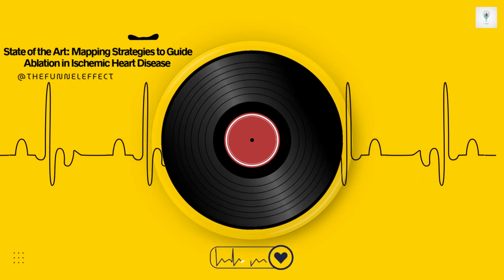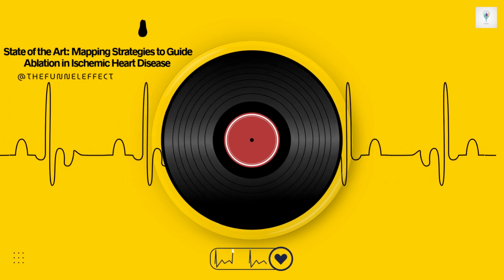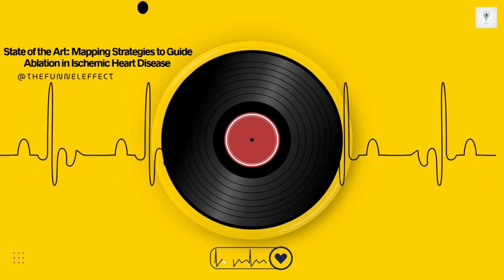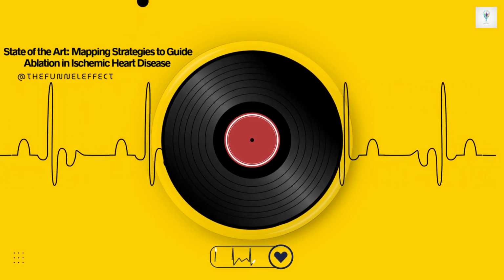The SQRS delay measures that transit time through the scar. The review notes that delays longer than 40 milliseconds are pretty common when pacing from within an isthmus. So, finding a perfect QRS match combined with a significant SQRS delay is very strong evidence that your pacing site is indeed the exit of a reentry isthmus. It acts as a surrogate marker for the isthmus itself.